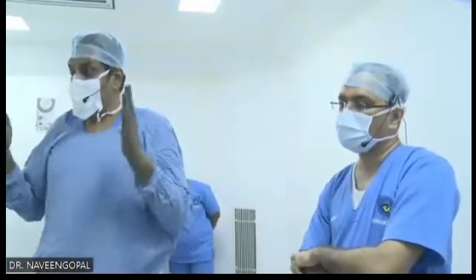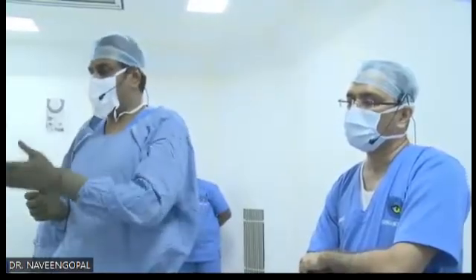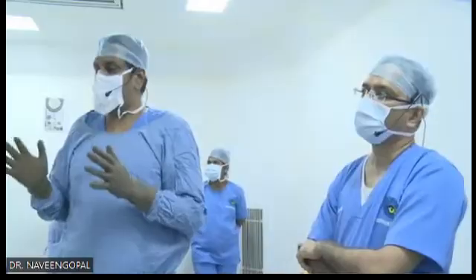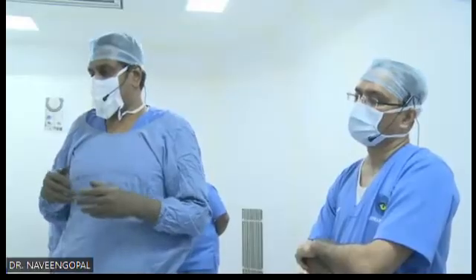Please exchange. Before exchanging, reassess the white to white, and then talk with your R&D group at the biotech, and then go for exchange. Because when you're going for exchange, the patient will already be traumatized mentally. I don't want us to go wrong the second time as well. So be prepared nicely for the second time, both theoretically and practically.